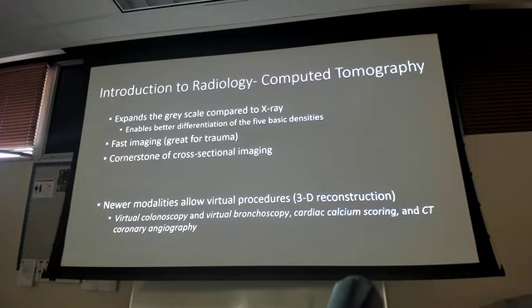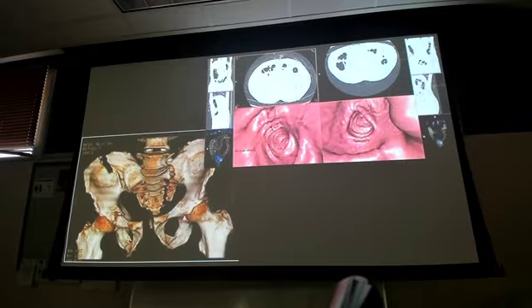All right. It is technically considered cross-sectional imaging, right? Because it's coming from different areas and it does the cross-sectional and then it gives you that 3D picture. Newer modalities that are coming out are starting to do more 3D reconstruction like that knee I showed you, but more importantly, they're doing it in this aspect, right? Colonoscopies.